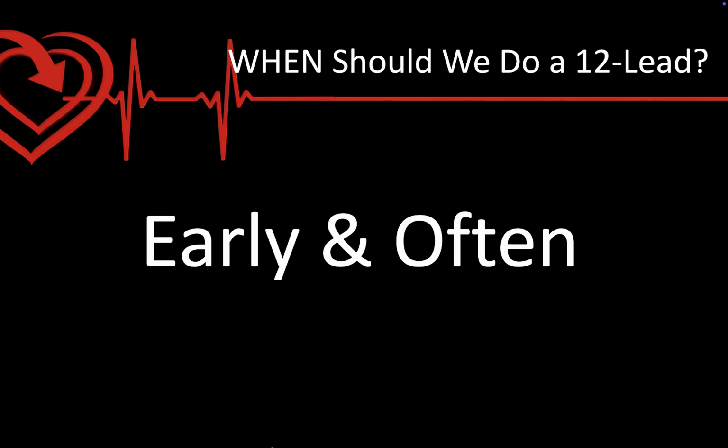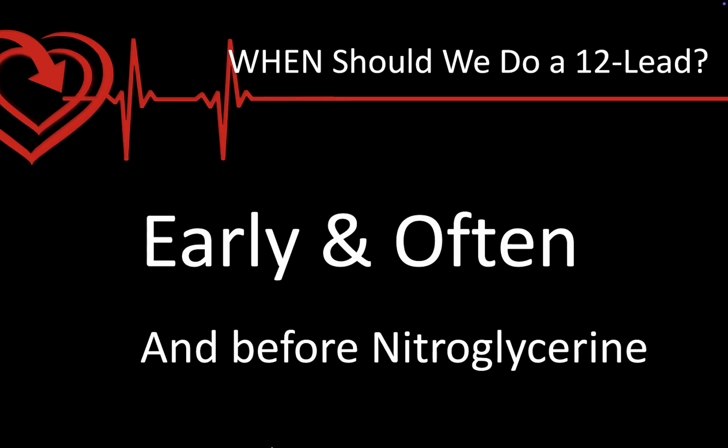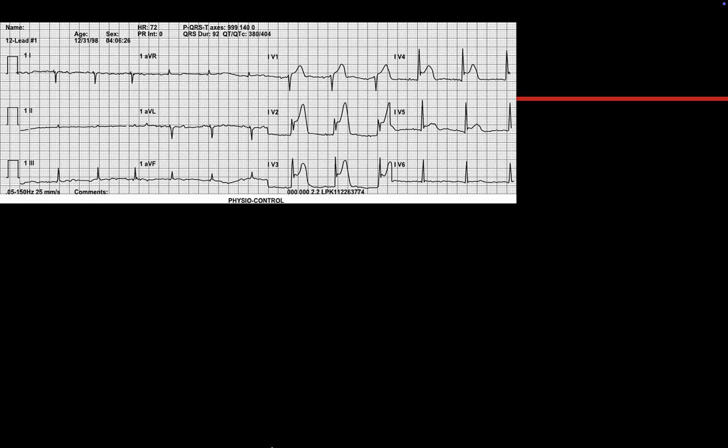And I say we do it often because evidence of a STEMI, evidence of an infarct, may not show up immediately, but it may show up as that infarct progresses over time. It's also important that we do it before we administer nitroglycerin to these patients. So when we think about how we're treating these patients and the timing of it, that's important to consider.